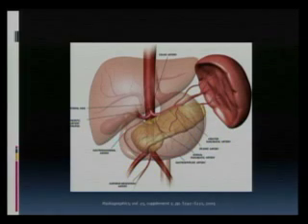So this is where it shows you the anatomy, right? The celiac, splenic, hepatic, there is the left gastric here. This is the GDA, which continues as the, what is this branch? Right gastroepiploic, okay? Here the left gastroepiploic is going to come from here. This main branch is the dorsal pancreatic artery, which is the main supply here. So you can embolize anything distal to it, but never embolize this. And this other major branch is known as the greater pancreatic artery. The short gastrics will come from here.